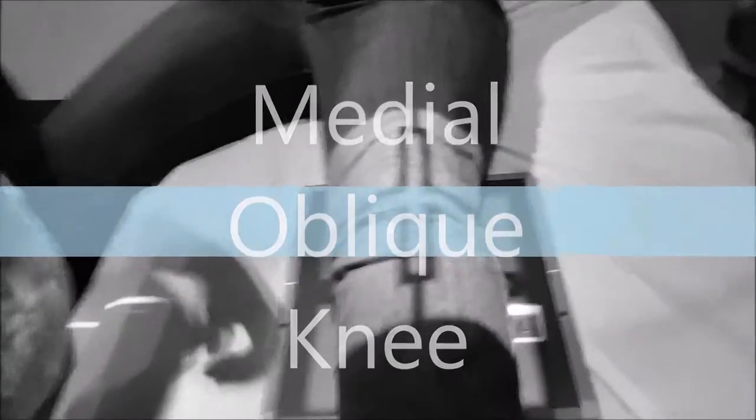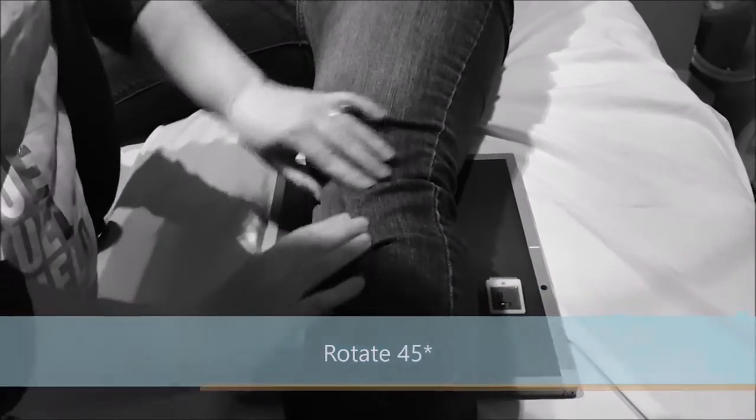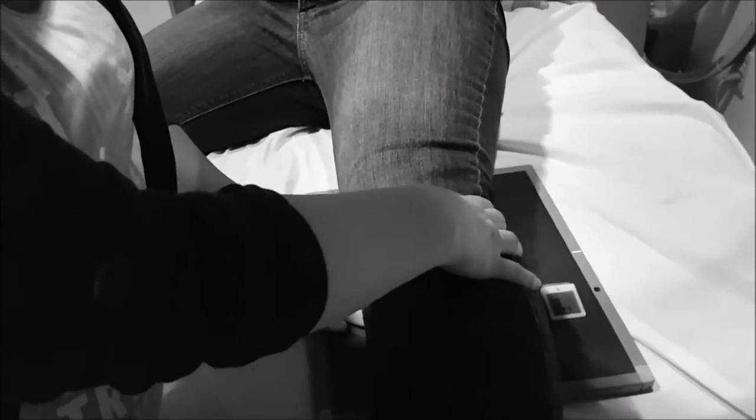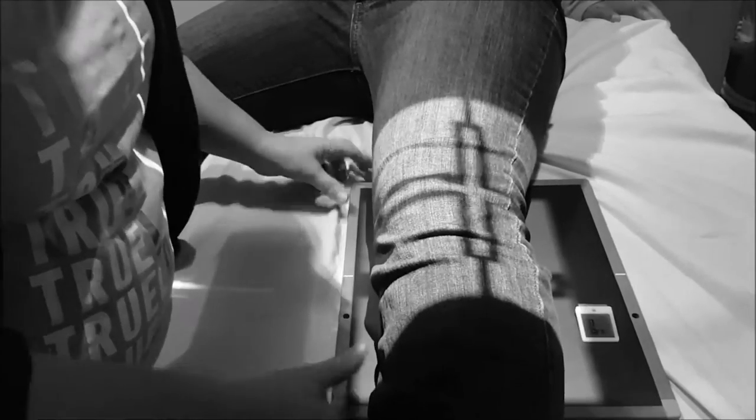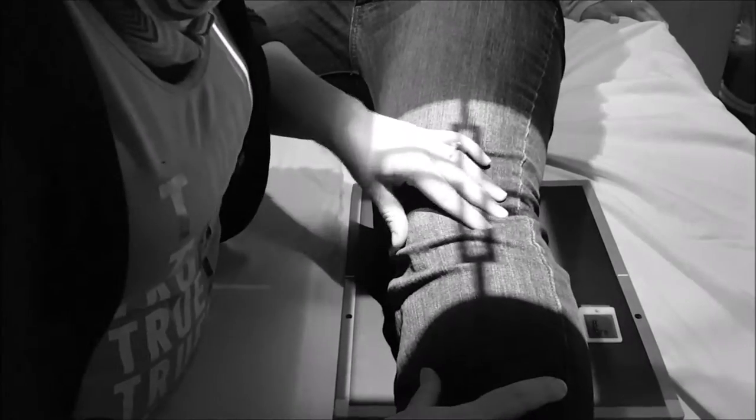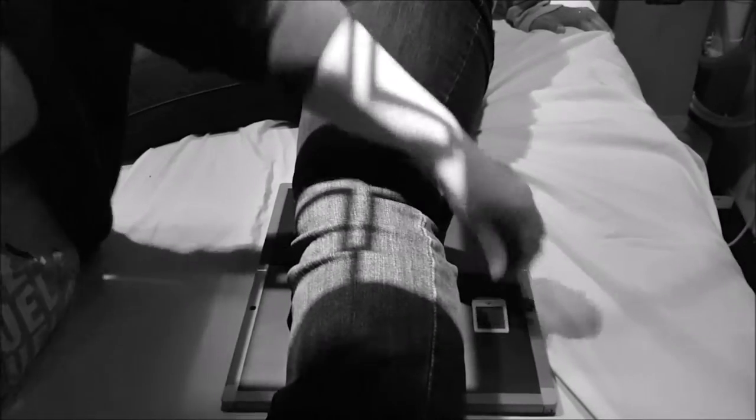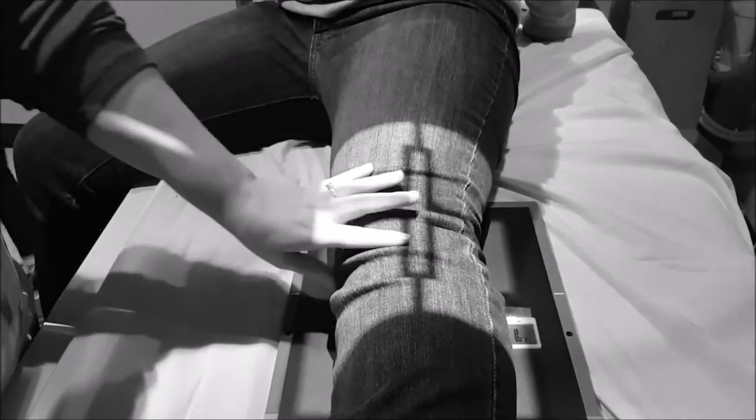For an oblique knee, we're going to do a medial rotation. You're going to rotate the knee in 45 degrees. So here's the patella here. We're still going to be centered a half an inch below the apex of the patella. And what we want to do is we want to open up the joint space between the tibia and the fibula. And we're still going to keep our 5 degree angle on the oblique.